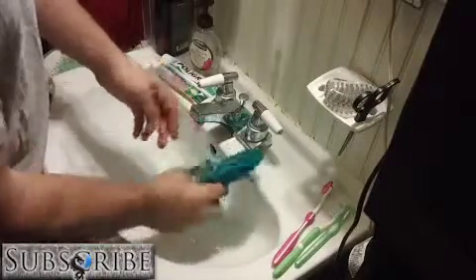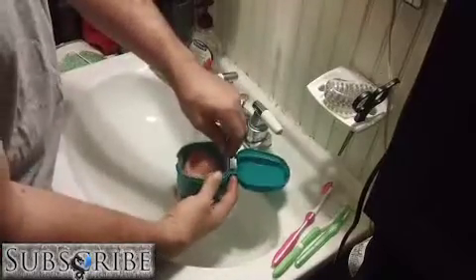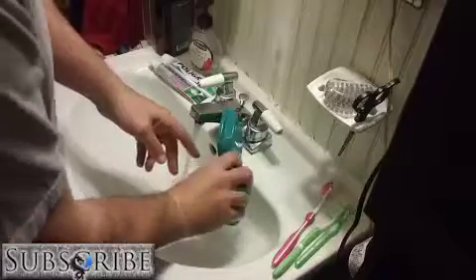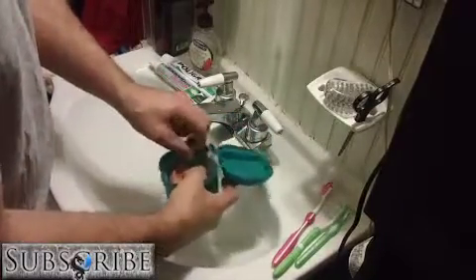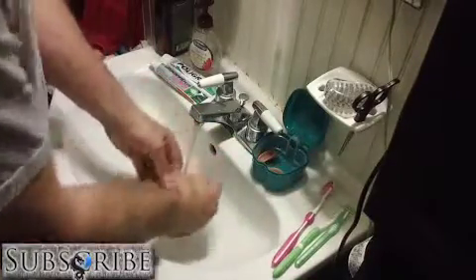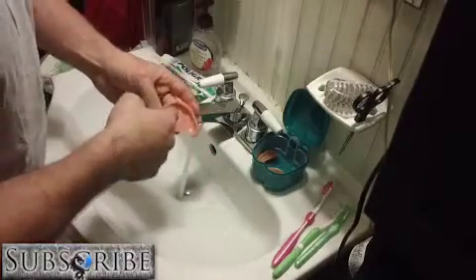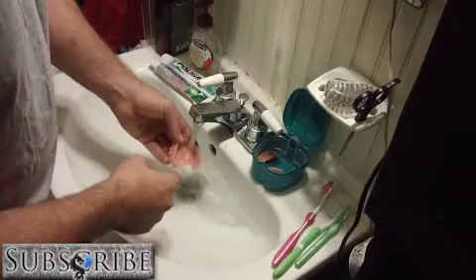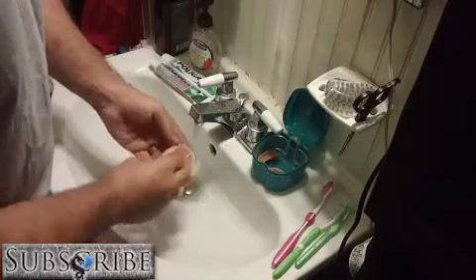Now this is pretty hot. It's got this thing here, so if you don't want to get your hands all wet, but I really don't care. I'll rinse it 2 or 3 times, like that. I'll bring the dentures themselves out and inspect for any little chunks of glue that are remaining, and usually just under the weight of the water, the water pressure, they'll come off.